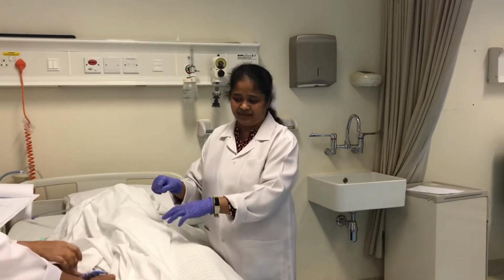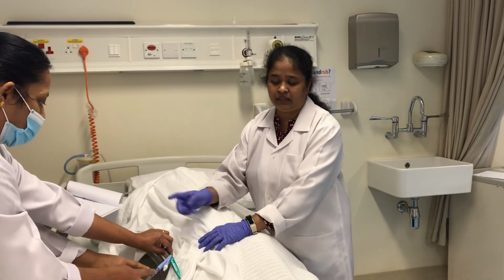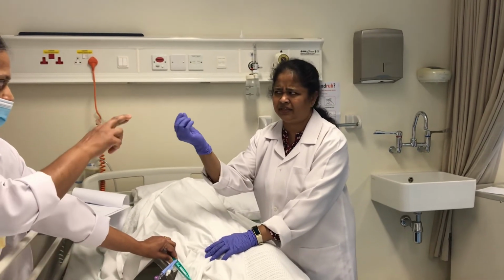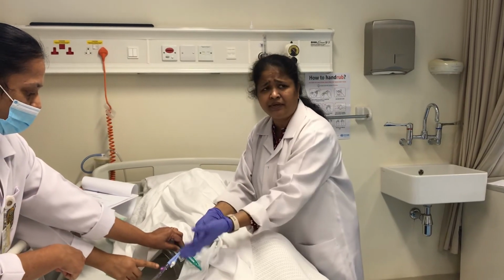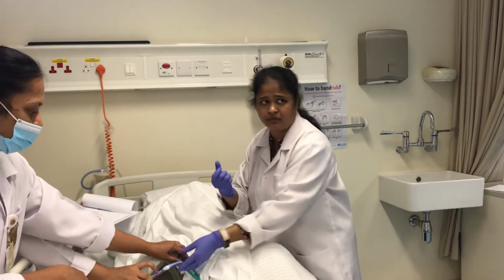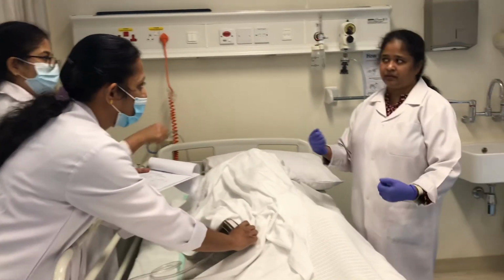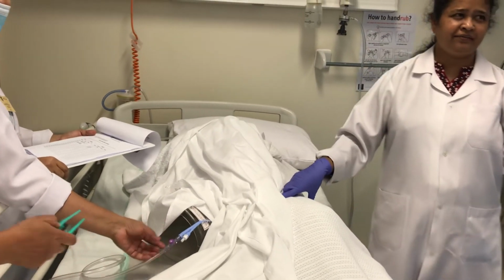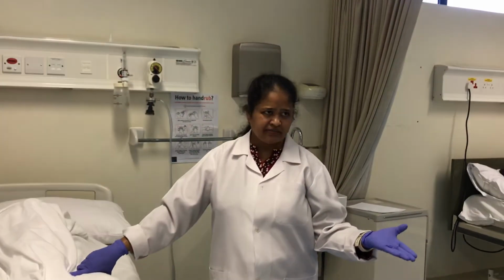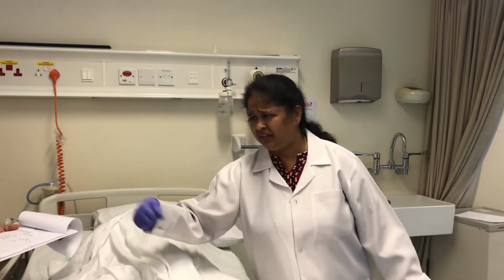Take a fresh sterile syringe, clamp it and then remove the urine. Or if it is coming automatically once you release it, you can also hold it. You can puncture and remove the urine from this. If they want, for example, culture and sensitivity, they have to be careful. I think they clean it with alcohol and then they take it.